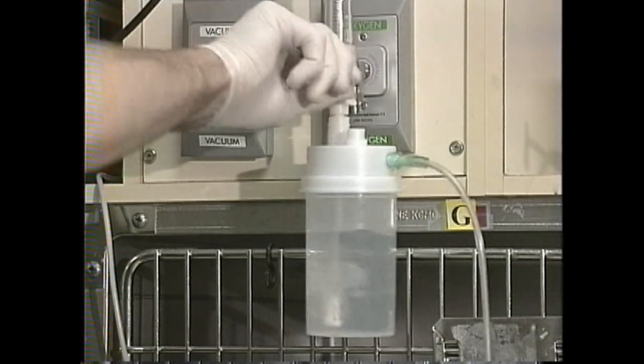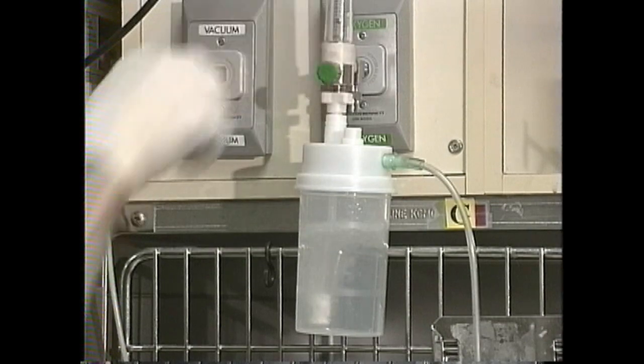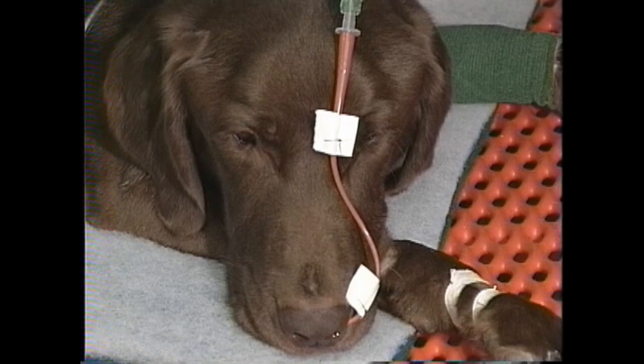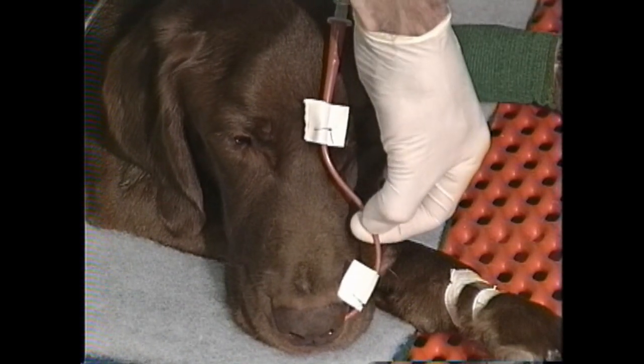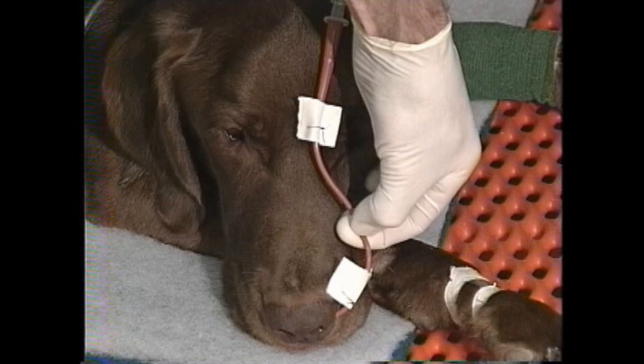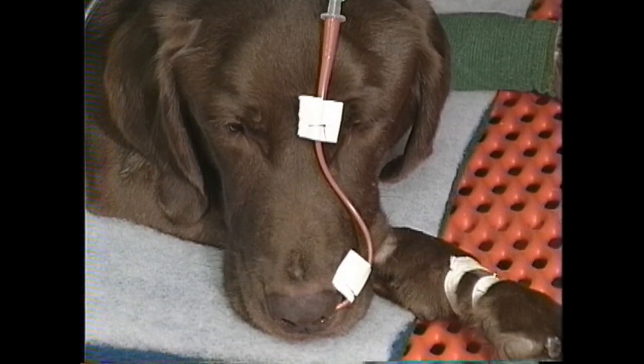I'll now turn on the flow. Typically the dose of oxygen is 50 mils per kg per minute to a maximum of three to four liters per minute. As a final check for security of the system I'm going to pinch the tube on the dog's nose — that should over-pressure the system and cause the pop-off valve to chirp or buzz, alerting you that the system is tight. If you don't hear the pop-off valve blow immediately or within a second or two, there's a leak somewhere in the system you need to attend to.